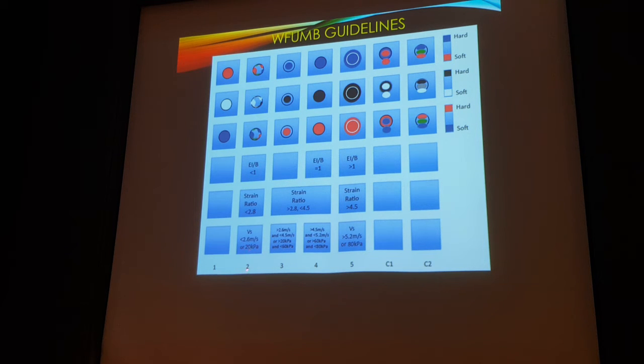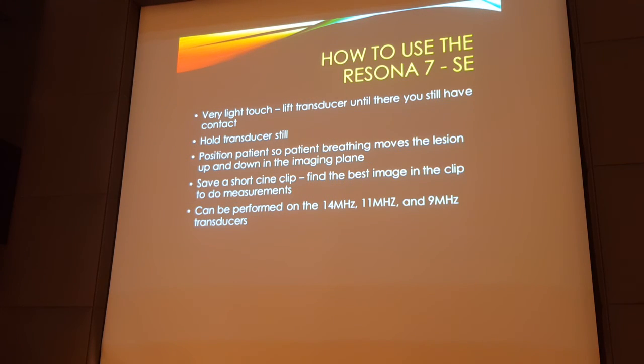If we look at the shear waves, all of the papers that had 20 kPa or less were benign, so we gave that a 2. All the papers that had 80 kPa or higher were malignant, we gave that a 5. Then in the literature, if you look at a lot of papers between 20 and 60, we gave that a 3. More papers considered that as malignant, so between 60 and 80, we gave that a 4. And again, part of this is vendor variability, particularly in the strain ratio. So you can improve this based on using one system.